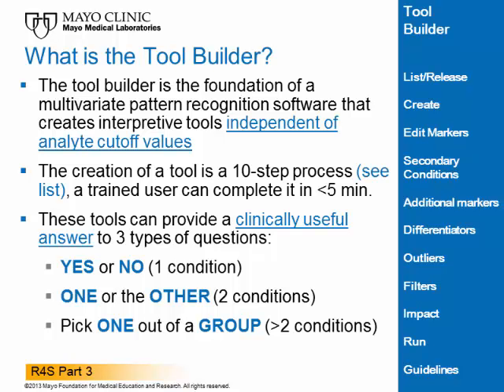A defining characteristic of the post-analytical tools is the evolution of clinical validation from the conventional static process, one usually performed early during test development, to a constantly evolving dynamic refinement of the disease ranges that continues to improve throughout the entire test life cycle process.